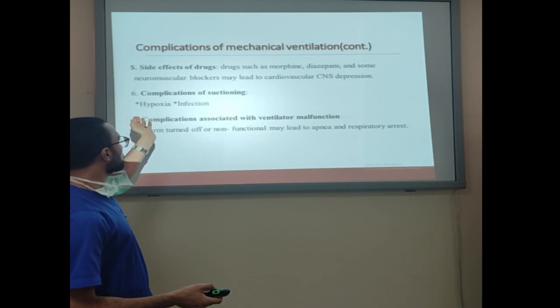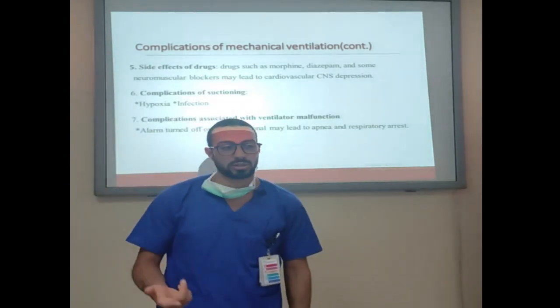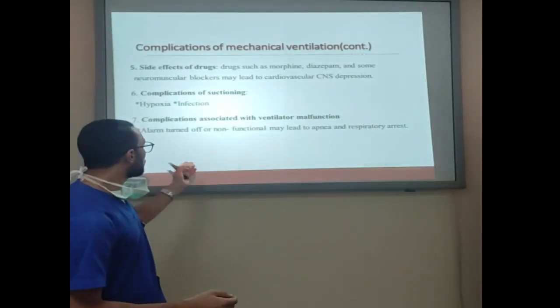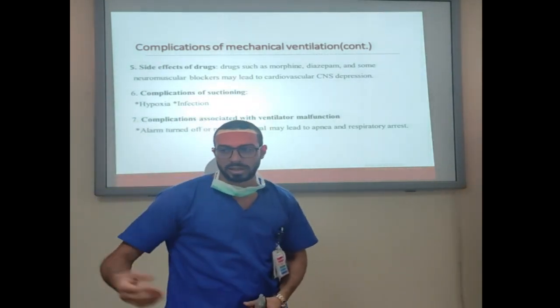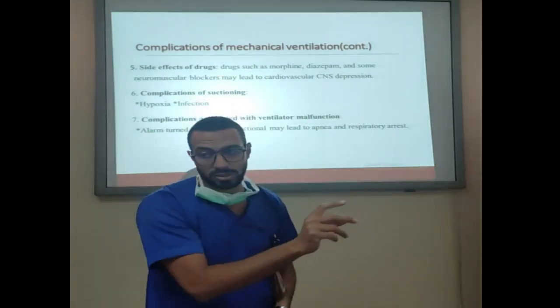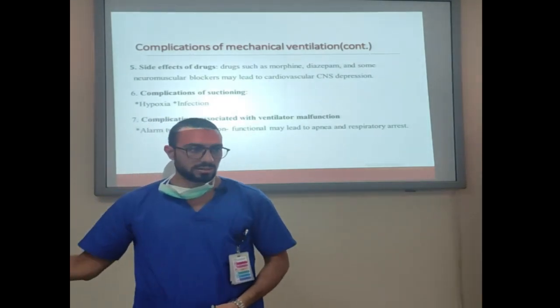Also complications of suctioning, like hypoxia and infection. If you are not managing the suction well, you can cause hypoxia, you can cause infection, and also complications associated with ventilator malfunction. Sometimes the ventilator is not working well, as we will say in the golden rules of ventilation. Maybe you attach the ventilator to a power source which is not the right source.